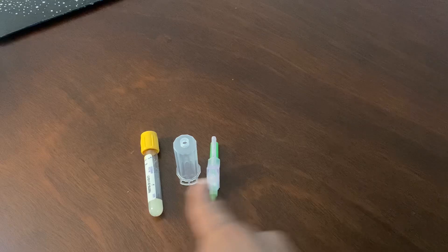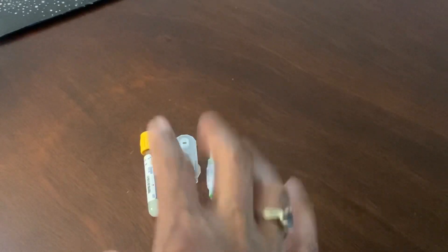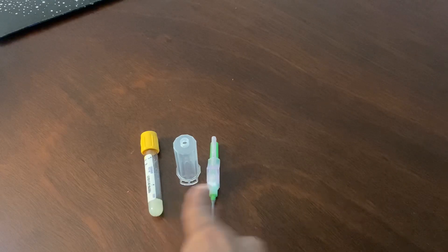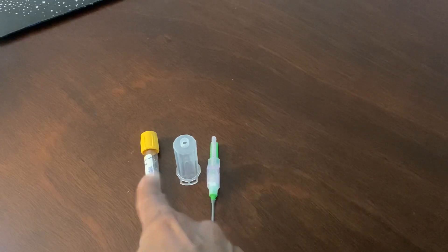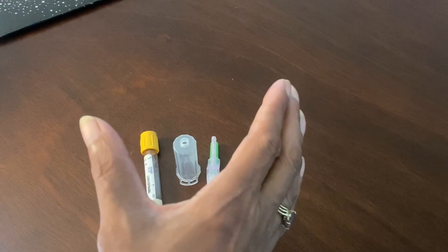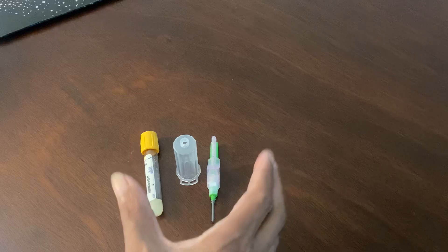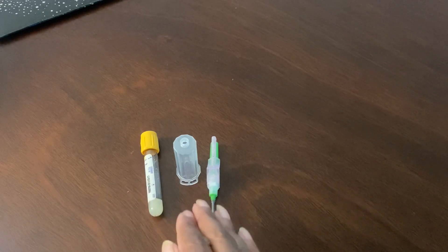So the evacuated system — you guys do know that this is a system. This right here, these three supplies, these three things, is called an evacuated blood collection system. It's a system because the three of them work together.